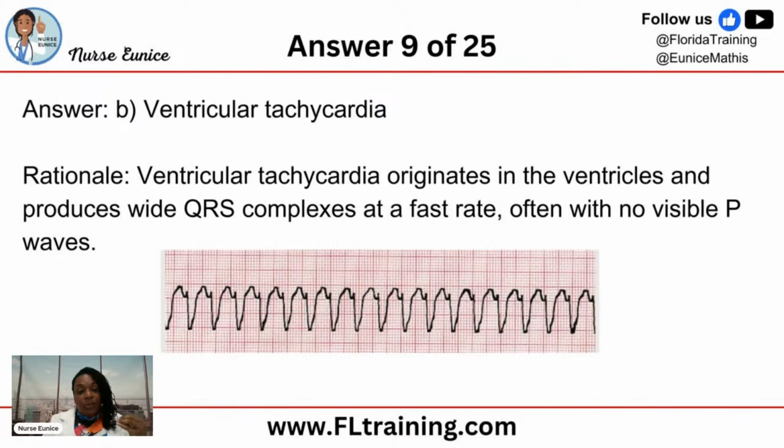But when you notify the doctor, you need to be notifying them with more than just the person has VTAC. How is the person presenting? What is their blood pressure? Did their mental status change? Did their medications change? So just seeing this on the monitor doesn't mean that there's a medical emergency.